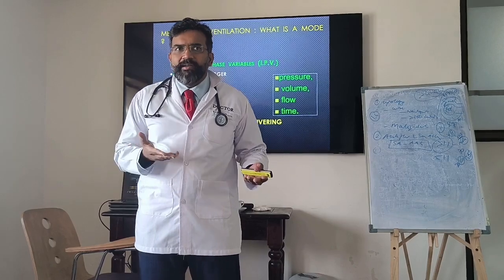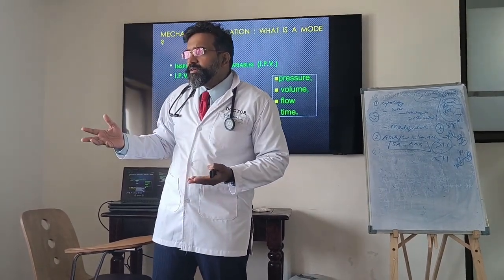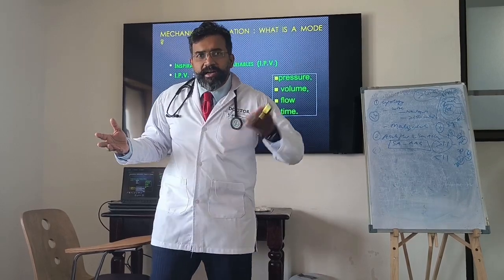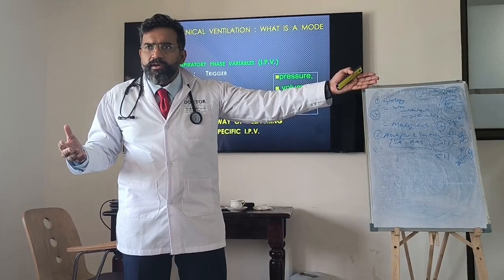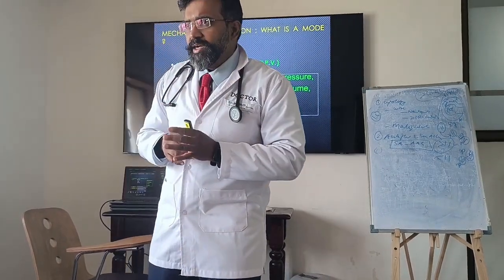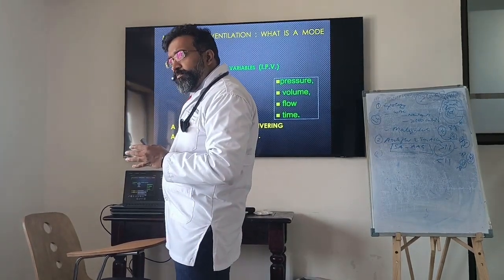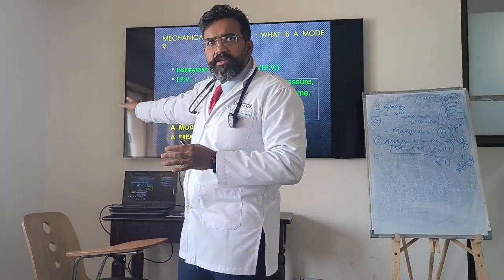BiPAP can even be bilevel positive airway pressure, which means IPAP and EPAP on an NIV, right? But in our Draeger, BiPAP means pressure control. So it is very important for you to understand the mode of delivery of the breath. If you understand the mode of delivery of the breath, you understand the mode.